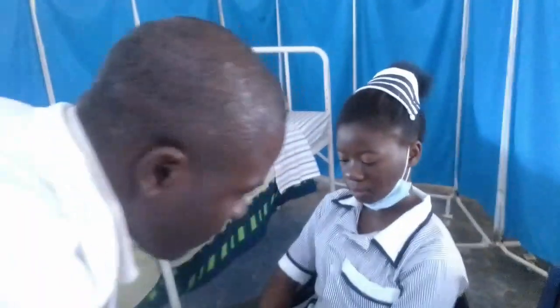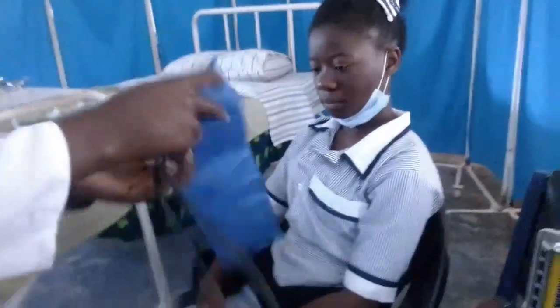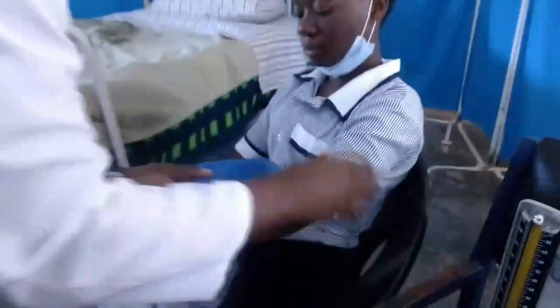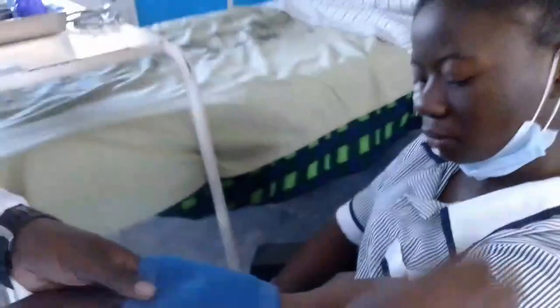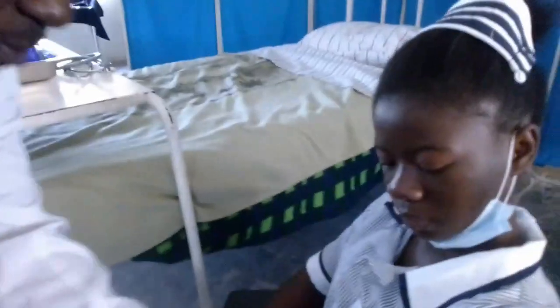Okay, so it has to be at the level of the heart, somewhere there. So at least somewhere there. It's okay. Here we go. So it will be a little bit uncomfortable, Ms. Kasapo. Okay. Because it will be tightening up, so it will be a little bit uncomfortable. So just have to bear with us. There's a little bit of pain.